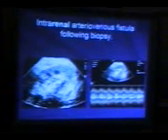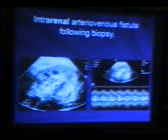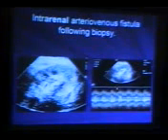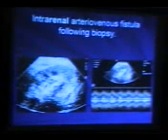This is an intrarenal arteriovenous fistula, which is common following biopsy in the renal transplant. As you can see, there is turbulence of flow due to AV fistula.